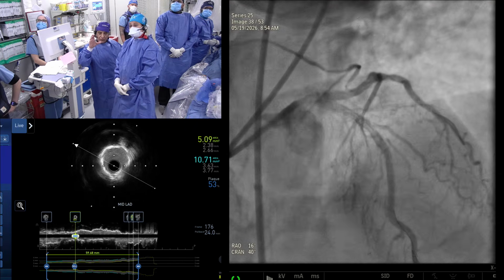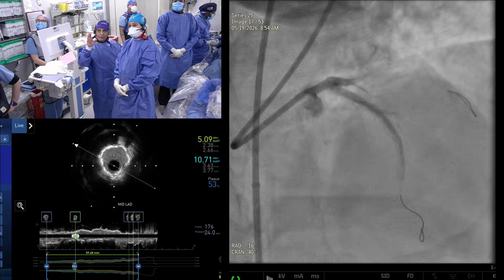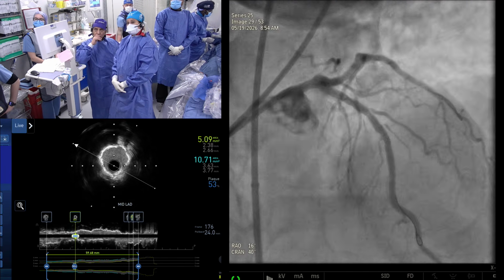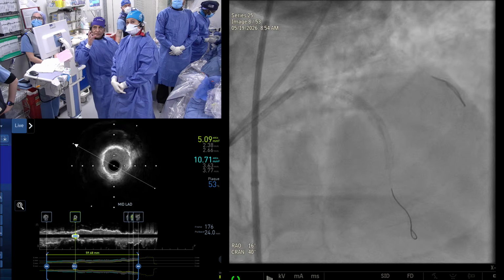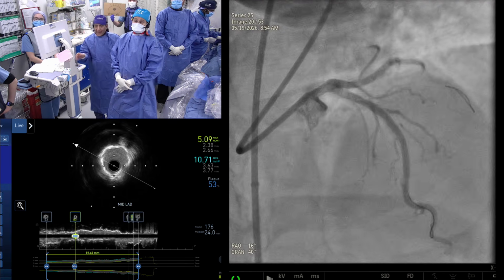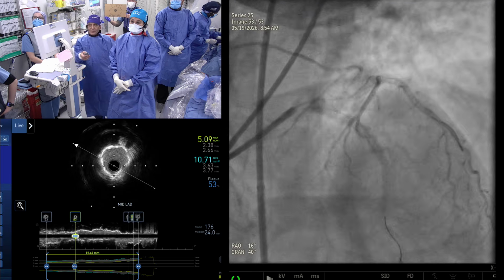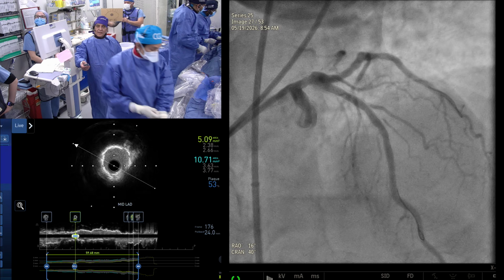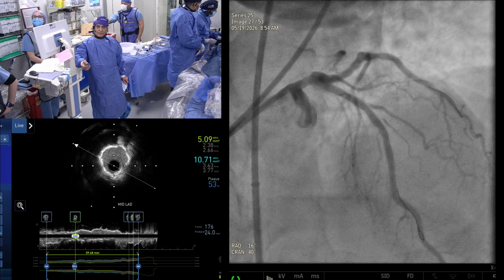So as much as you can go, we also know if you become too crazy, you'll rupture the vessel, even with the calcium and stent. But an excellent angiographic result of this complex case, and it came out with a single stent strategy. That was our plan. Good. So after this, let's complete our presentation. We are getting to our time, so let's go back to the slides again.